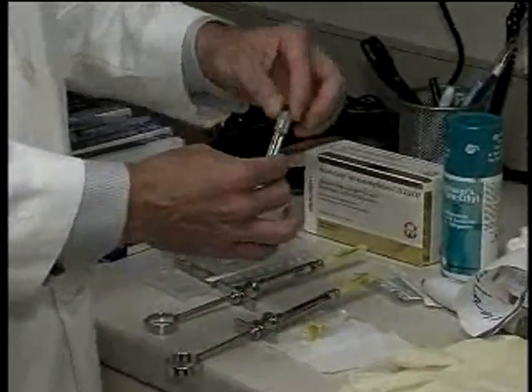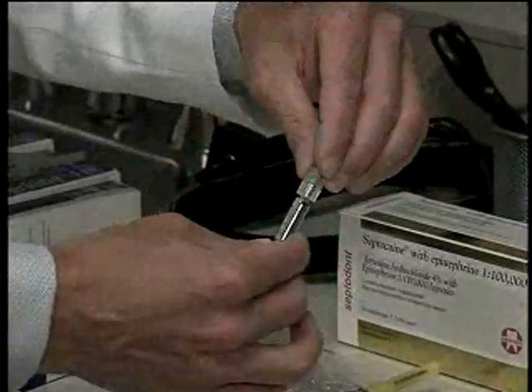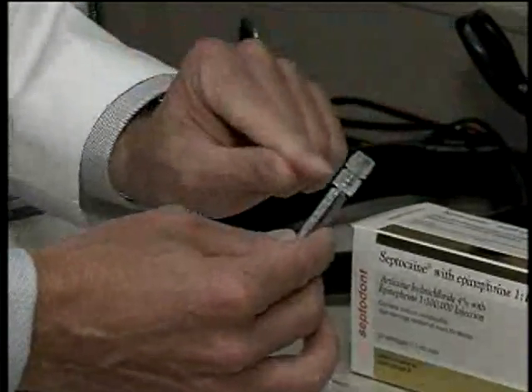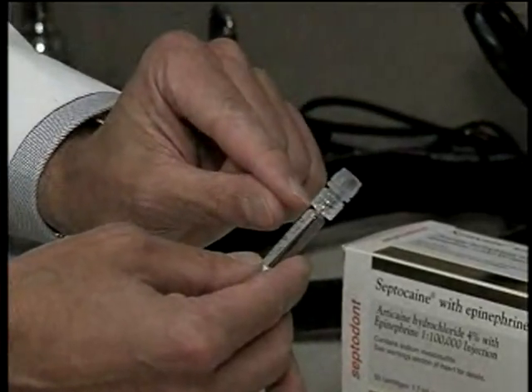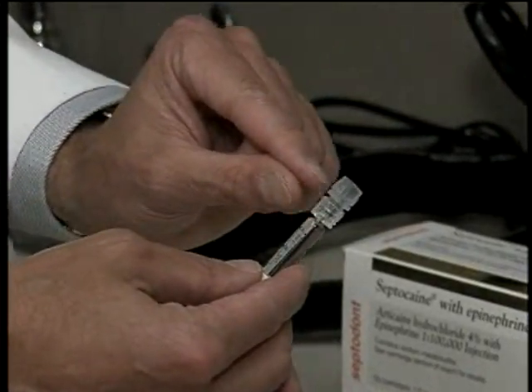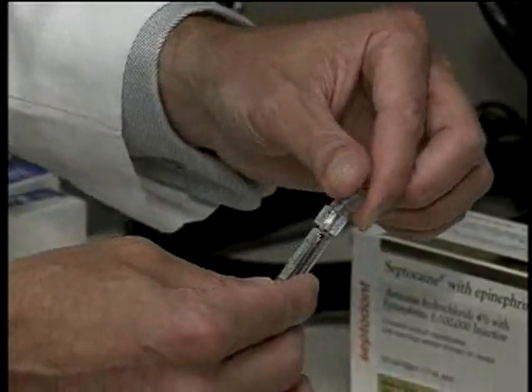When removing the cap, you have to be very careful here. There's a cap here, and then there's a hub. You want to unscrew this cap gently, and you don't want to touch this hub. If you touch this hub and weaken this hub and loosen it, you risk that the needle will pop off during the treatment, and that's never very nice.